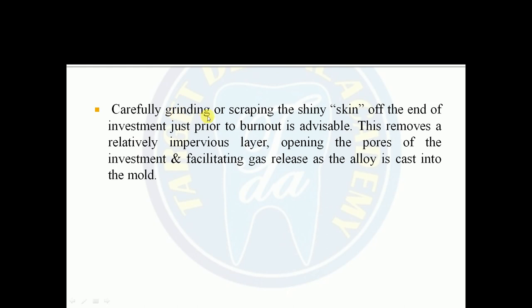Now, carefully grinding and scraping the shiny skin at the end of the investment just prior to the burnout is advisable. This removes an impervious layer, opening up the pores and facilitating the gas release as the alloy is cast into the mold.